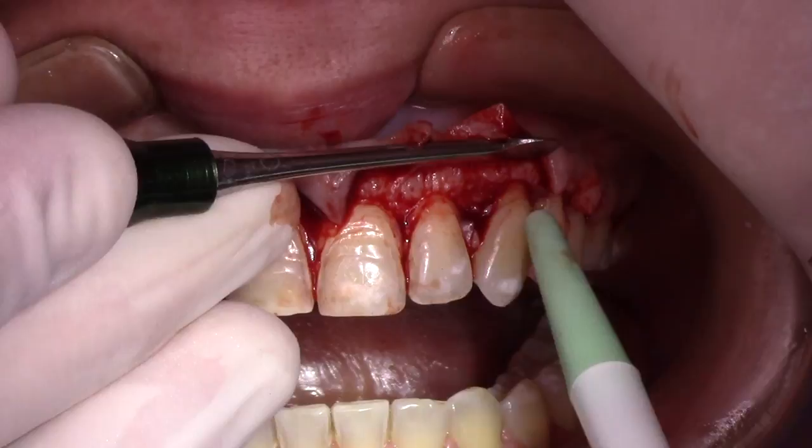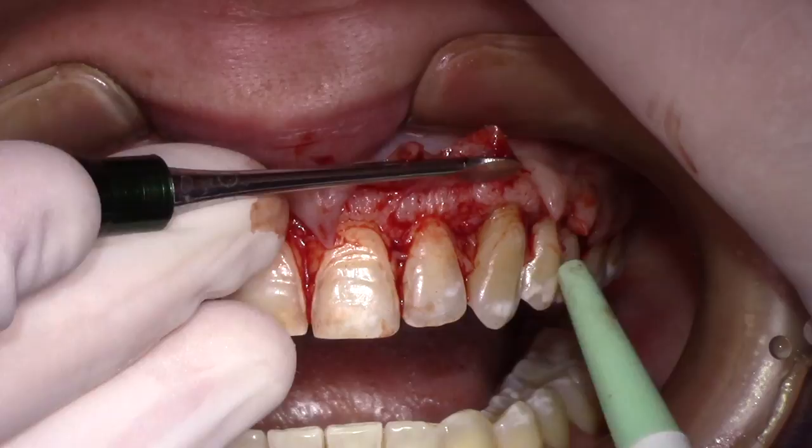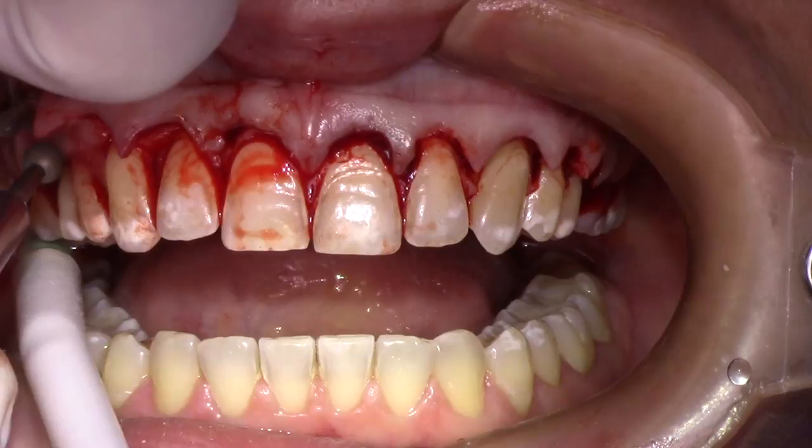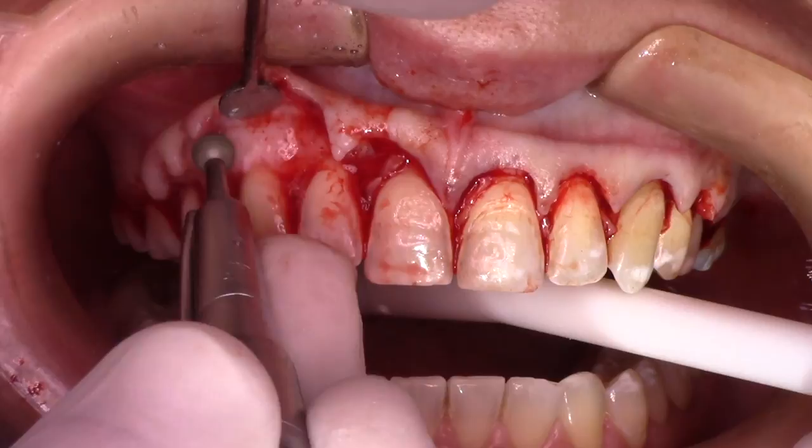The first tip I can give you is beveling the incision according to the thickness of the tissue. For thin tissues, do not bevel — go to a 90-degree incision. For thicker tissue, you can go to a 45-degree bevel to have a better fit at the end of the surgery.